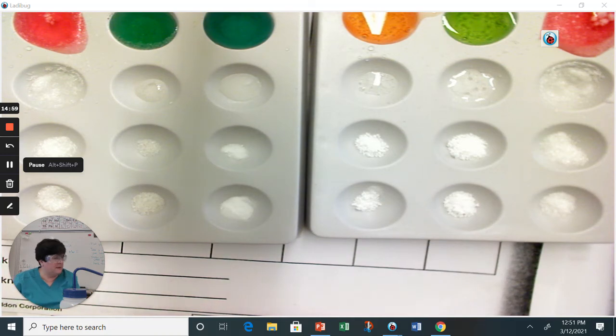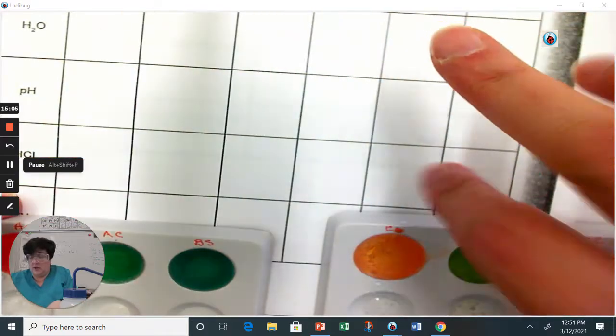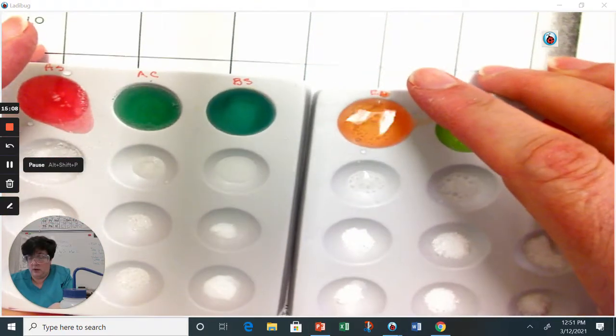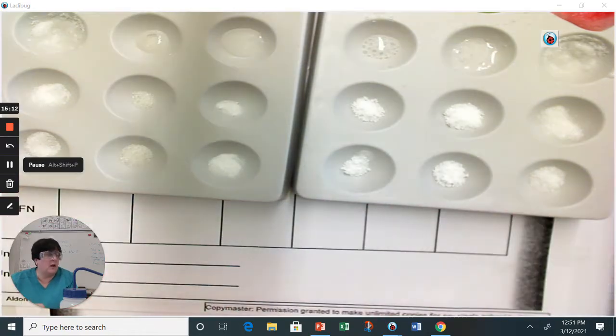All right, last part. Record this. This goes into the row that says reaction with HCl. And then we're going to have our final reaction. I had some extra there so you can go back and look at observations of what it looks like unaltered, unreacted.